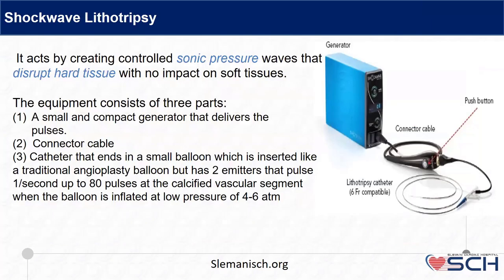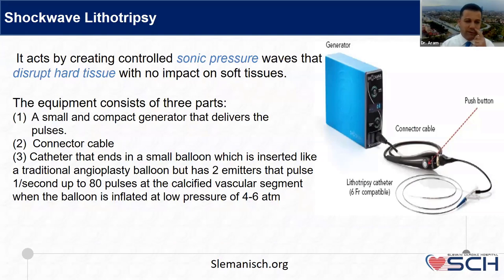Nowadays, in the last 2 years, a new device has been introduced and approved by CE marking, which is shockwave lithotripsy. Actually, this device is very good. It is very easy to use compared to the Rotablator, but I don't think that it is available yet in our country.